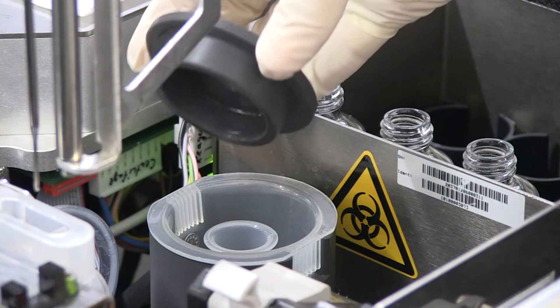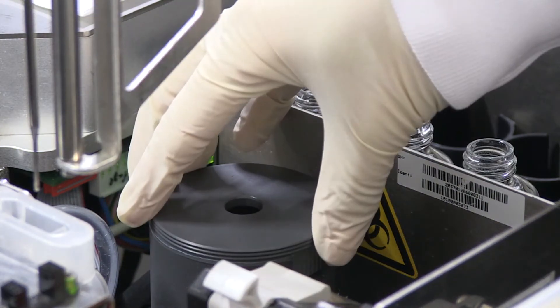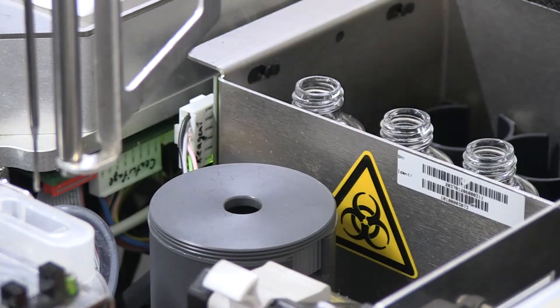Reinsert the gray plastic cover. Thank you.